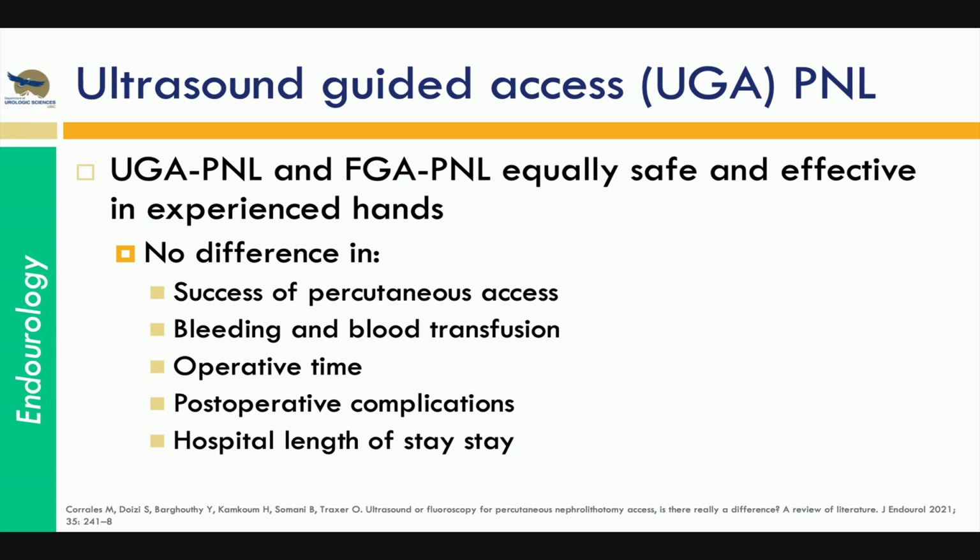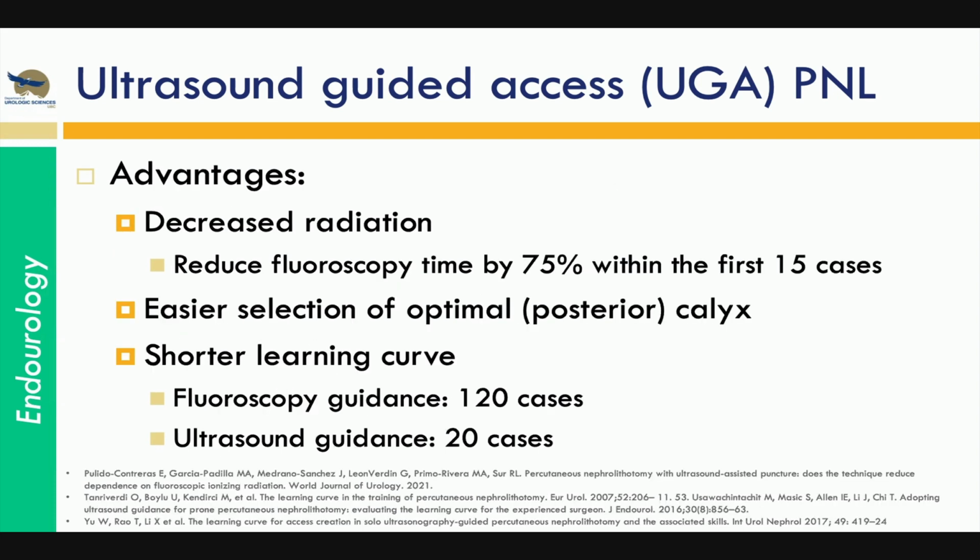No difference in bleeding and blood transfusion, no real difference in operative time, no difference in post-operative complications, and no difference in hospital length of stay, which is very impressive. And the other thing is that in addition to not having any kind of clinical disadvantage, you actually get the advantage of significantly decreased radiation time.